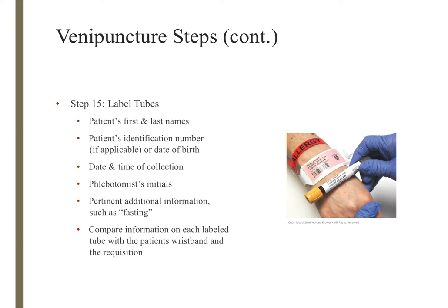If you use the same perfect technique with ID in a patient every time, when you're working in a place and there's a misidentification, you will know your steps and everybody will know that you always do it this way. And I'm telling you that because that has helped me. What will happen, and this should not happen, they'll leave their computer open because it's easier than everybody logging in to their own thing every time when you're in a busy place. And one person will be there, and so it'll be their initials on all the tubes.